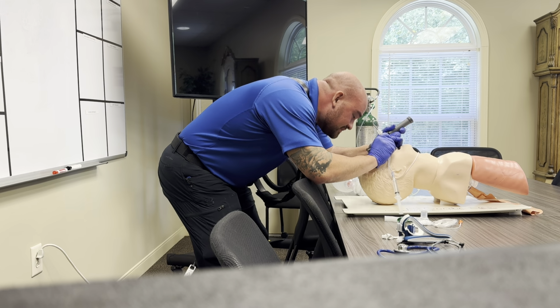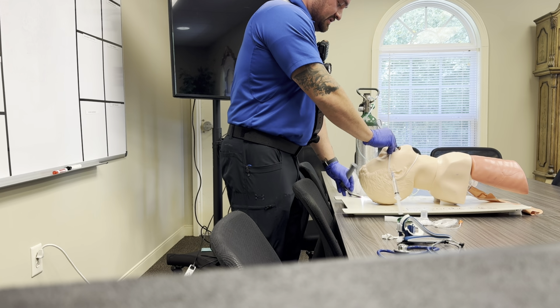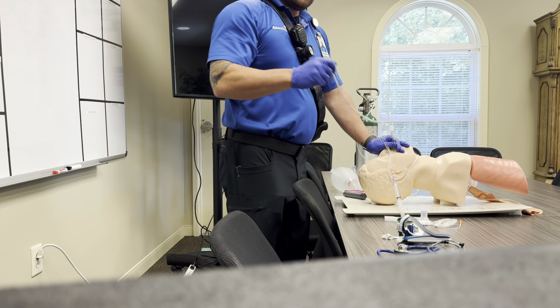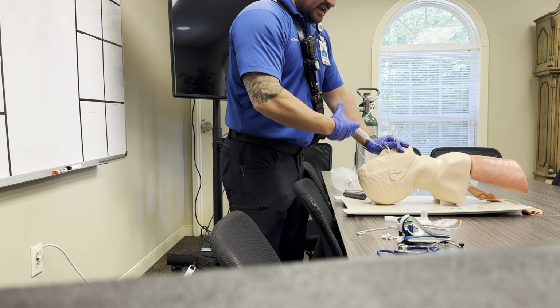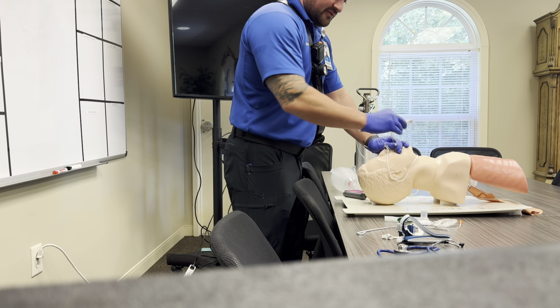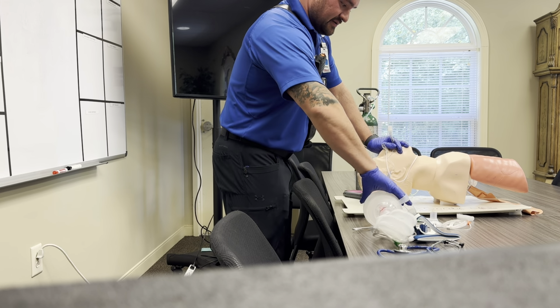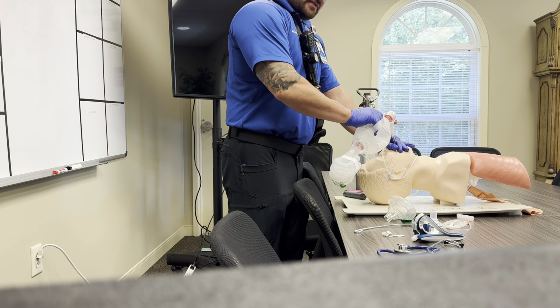So we're gonna go in just past where we see the bulb disappear. So without removing your hands from this tube, hold on to the tube. Pull your stylet or your bougie, whatever you're using to introduce. And you want to go ahead and fill your bulb with air and remove that syringe. Next, you can either do this yourself or with your partner, go ahead and see if you get good chest rise and fall, okay?